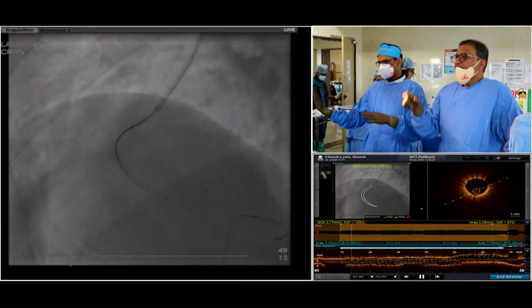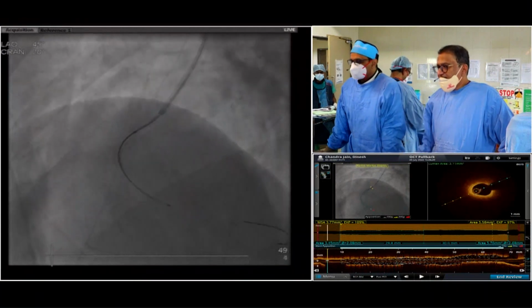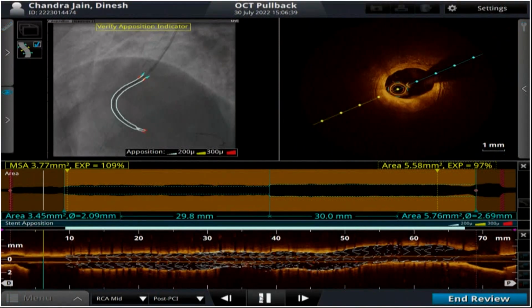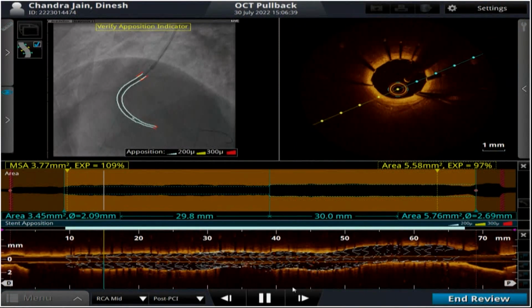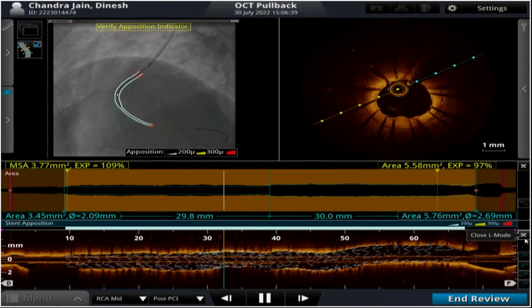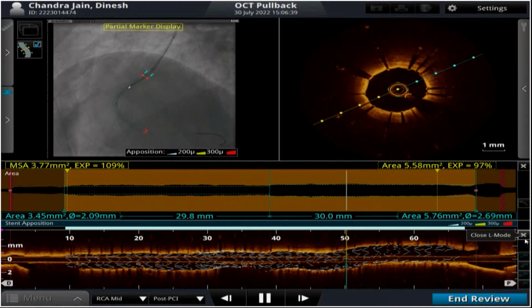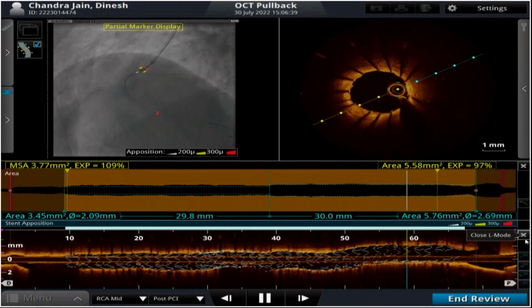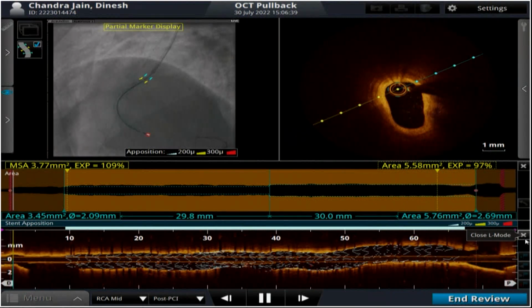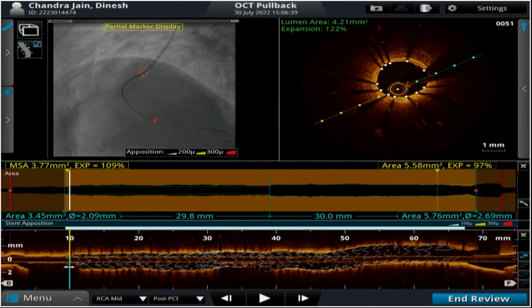Again, you can see the OCT. Is this without contrast here, the run? Yeah, we'll show you the OCT here. Play it on full screen, please. Is it visible now? Yeah, it looks nice with full stent expansion. Some prolapsing parts of dissected areas, but I think it looks very, very nice. So do you believe there is one more post-dilatation needed? Not really.